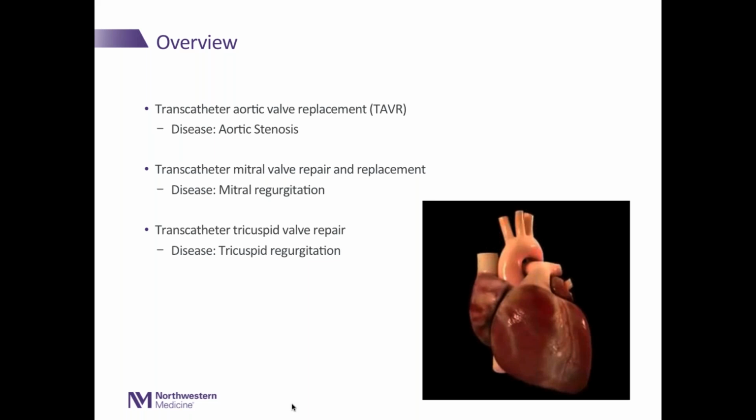10 years ago, the topics that you're seeing listed there under overview about replacing heart valves without surgery, transcatheter mitral valve repair, and tricuspid valve repair, we weren't even talking about them. They weren't at our meetings. We weren't considering it for patients. It wasn't anything that we discussed. So in the past 10 years, there's been this revolution.